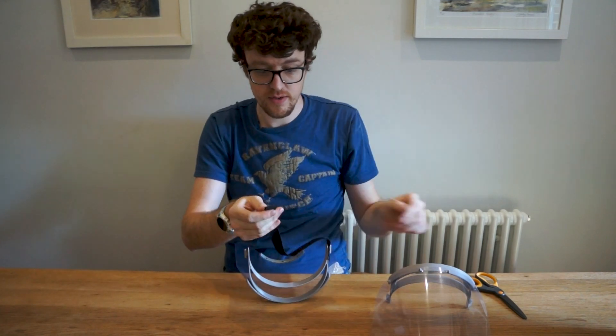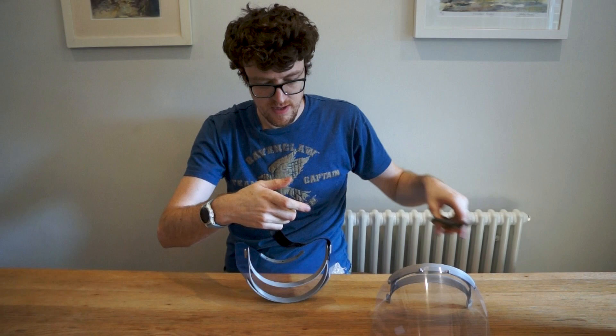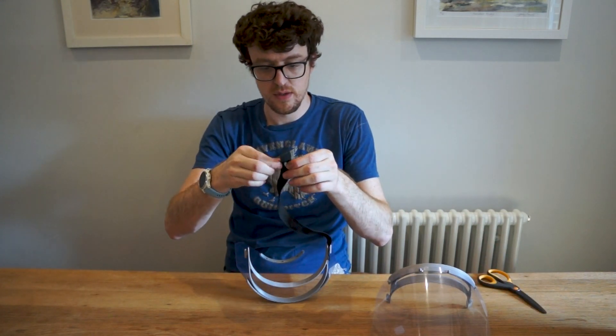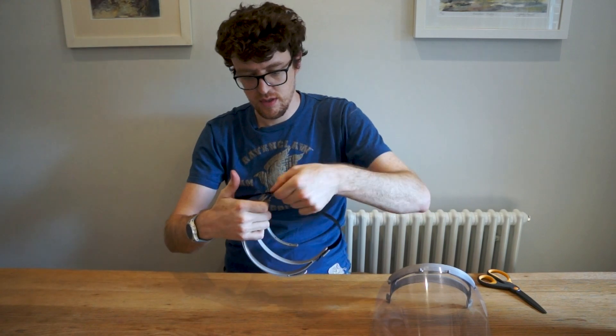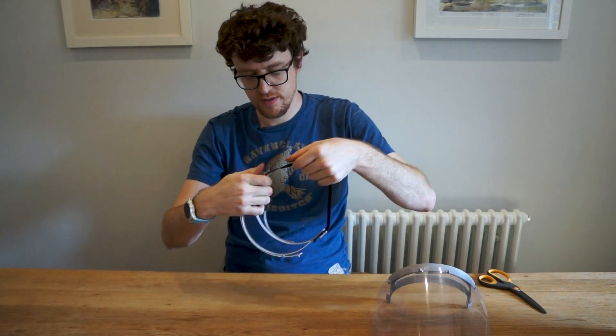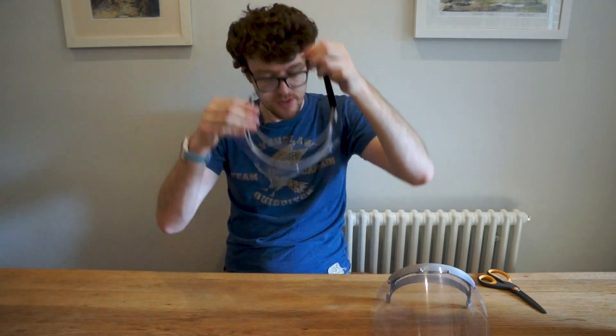Fold that back on itself again on that side, cut it with the scissors, and you can see there's a hole in there now. Make sure it's not twisted, and then just put that over the top on that side. Now you can see that's quite tight and isn't coming off easily, so that's it.